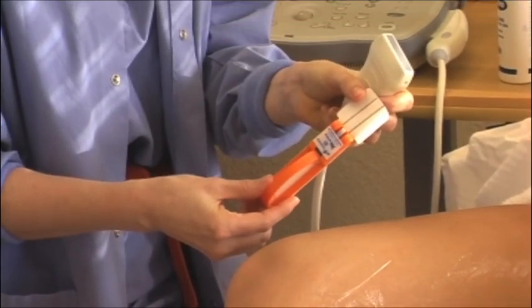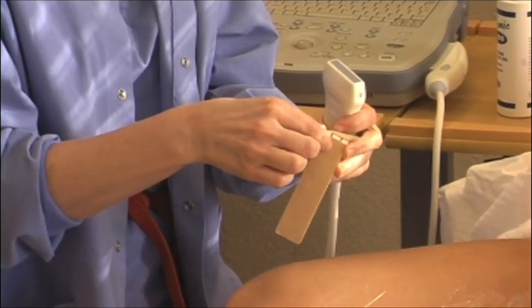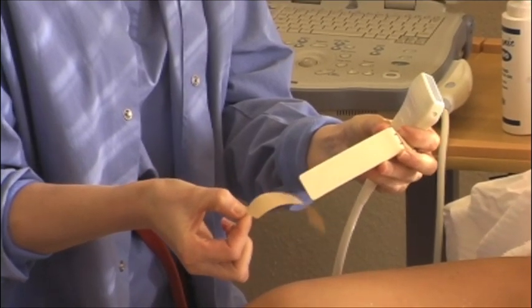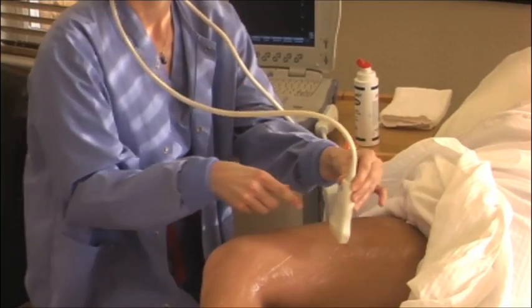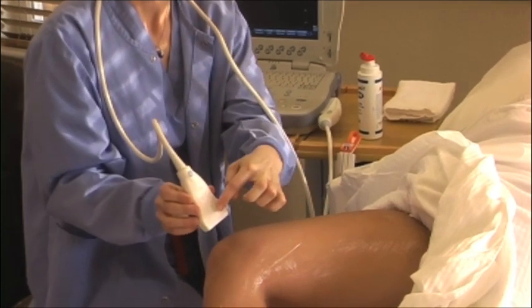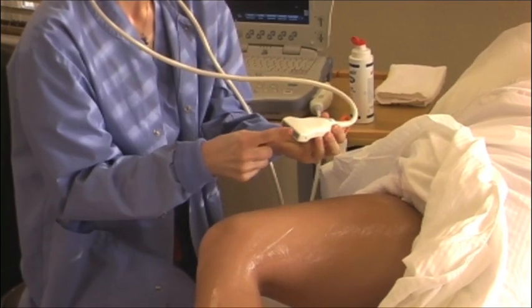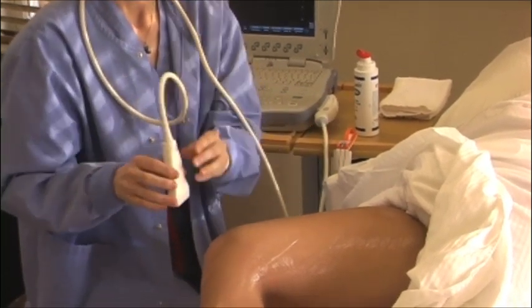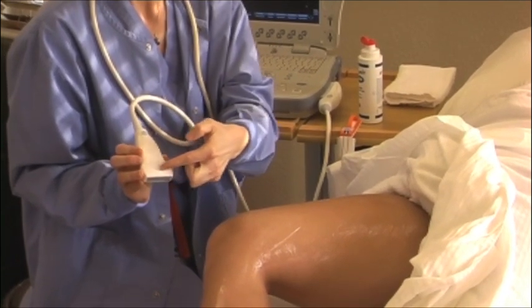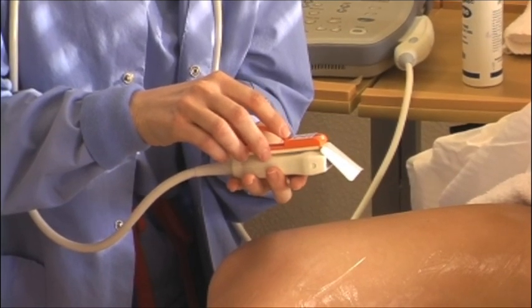To apply the AIM device to the transducer, first remove the paper backing. As you scan distally, this is the leading edge of the transducer and this is the trailing edge. This is the scanning surface of the transducer. The AIM device should be applied approximately 5 mm above the scanning surface of the transducer. Center the AIM device on the trailing edge and adhere it to the transducer.